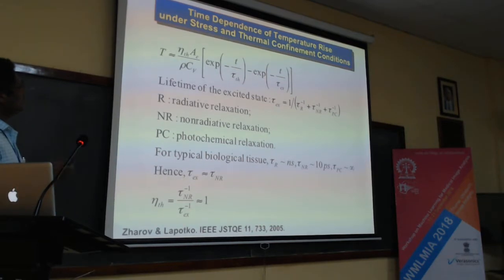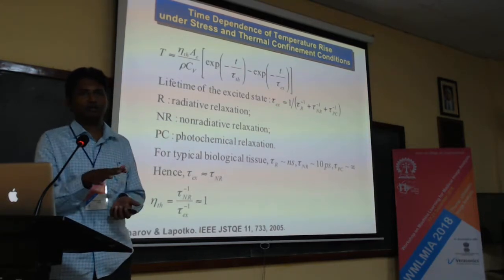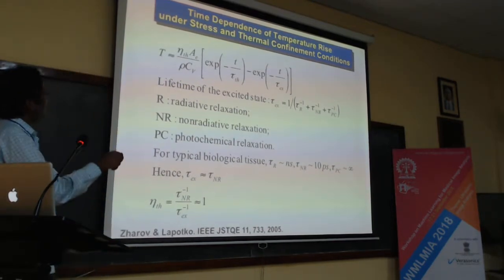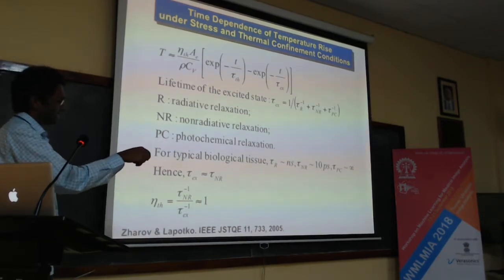Now, we are only talking about temperature sensing, which is more about thermal diffusivity. But you can also come back and look at stress and strain relations, and look at how the thermal confinement conditions vary because of the stress. And then there is something called the lifetime of the excitation state.